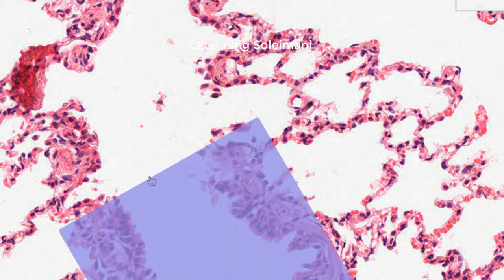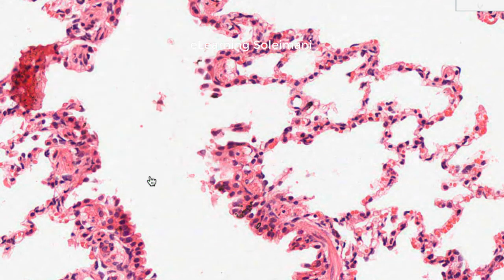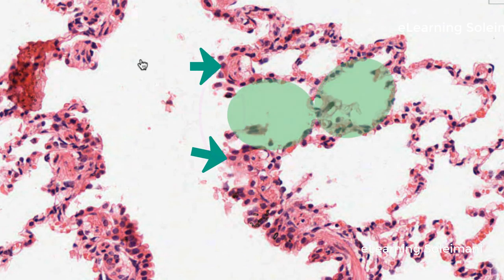The terminal bronchioles open into the respiratory bronchioles, which are short, transitional regions of bronchioles that have a few individual alveoli in their walls. The walls of respiratory bronchioles might have small knobs of smooth muscle, collagen, and elastic fibers between the openings of adjacent alveoli.